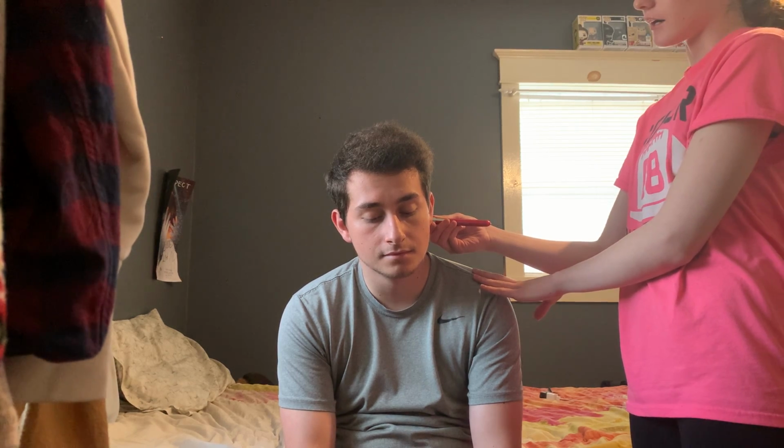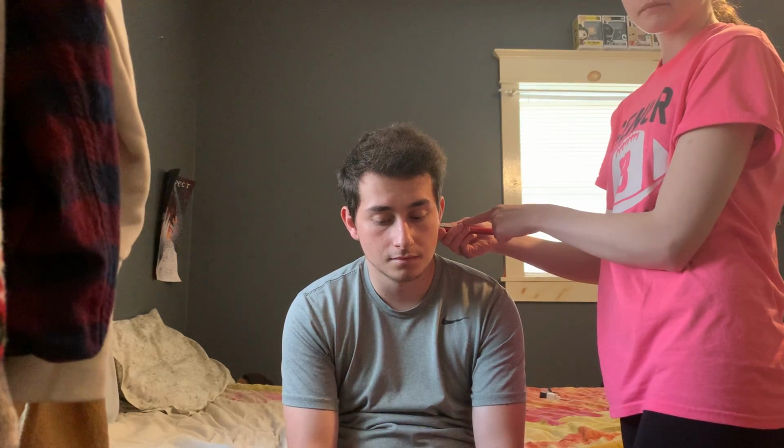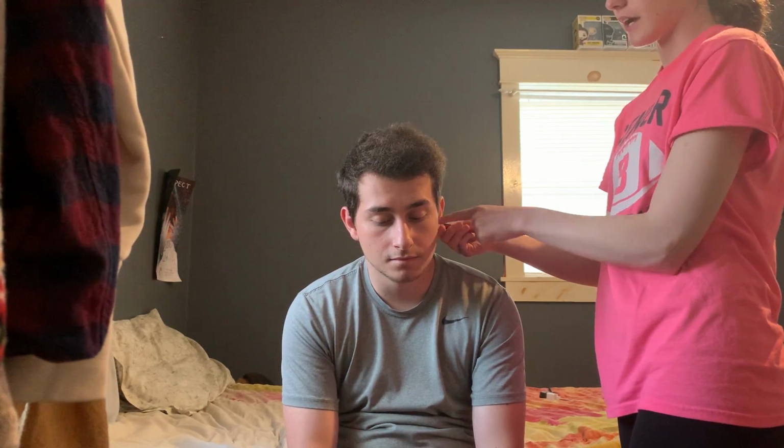Once he believes he stops hearing the vibration, I'm going to move it right in front of his ear. And this is the air vibration, and he should be able to hear the air vibration even after he said it was gone on the bone, because the air is more sensitive than the bone. And I would do this on both ears.